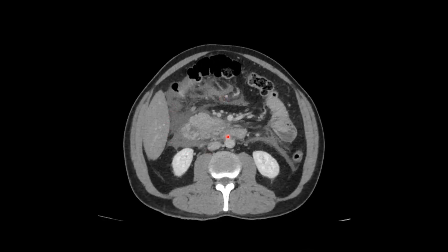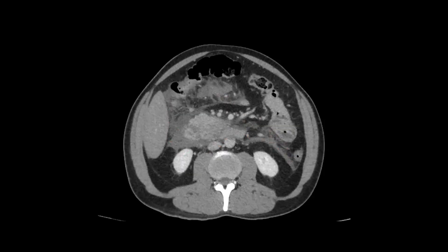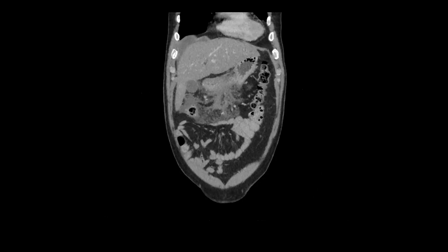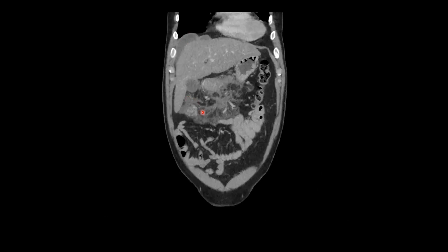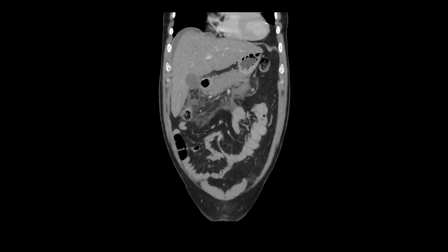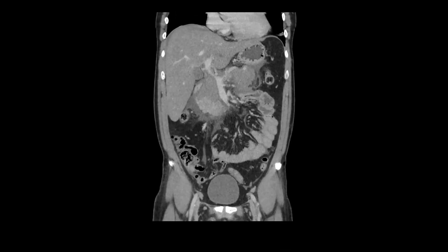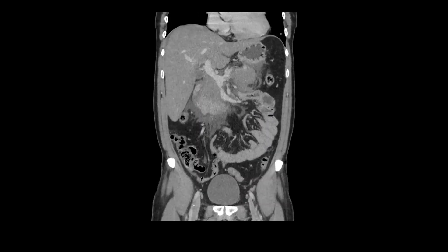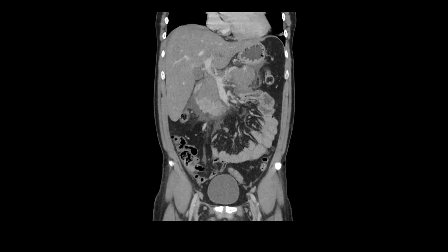We're also seeing more peripancreatic fluid and edema as we track inferiorly. Jumping ahead to the coronal formatted images, we can again see that perihepatic ascites but more extensive peripancreatic edema and fluid. The coronal formats are a great way to look at the pancreas because you can see much of it on a single view. Look at how sharply defined that interface is between the normal enhancing pancreas at the inferior aspect of the pancreatic head and then the remaining hypoattenuating pancreas.